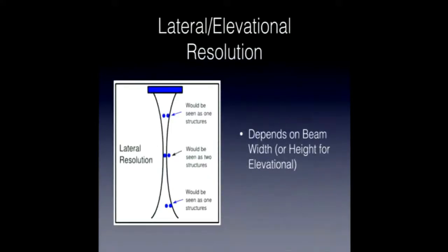I'll talk briefly about lateral and elevational resolution. They're somewhat similar. They're based on the design of the probe face. And so lateral resolution, this also brings up another point, is the focusing of the beam. And we'll talk about that in a moment.